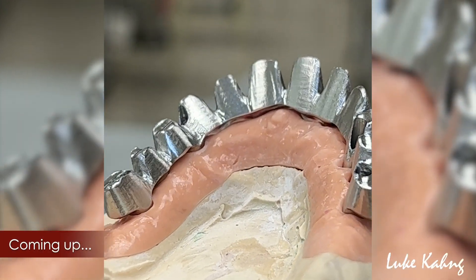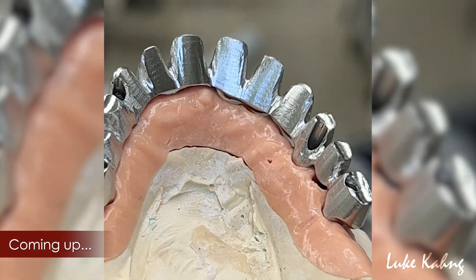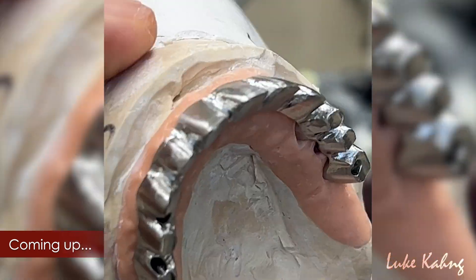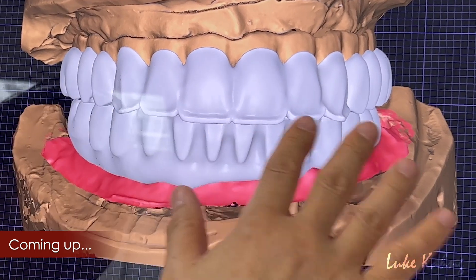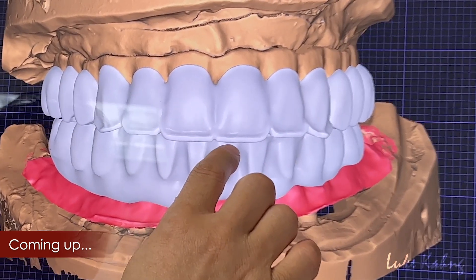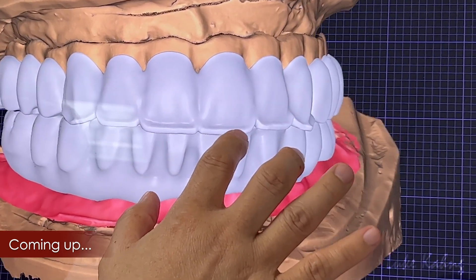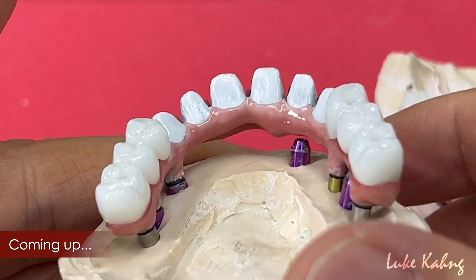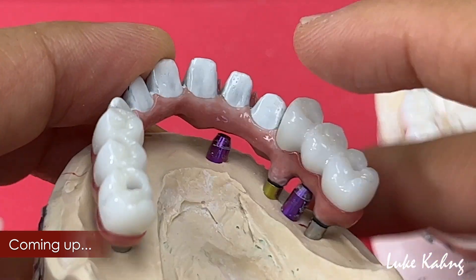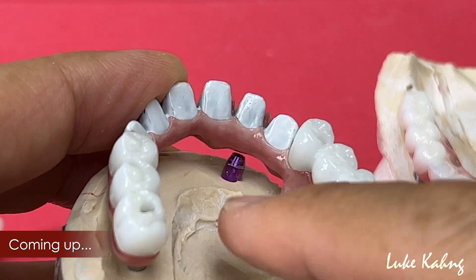We finished the five implant case. It's a bicon implant. It's extremely thin and long span for anteriors. Zirconia is not recommended. This is what it looks like — we overcome the obstacles about the long span and trying to make it as thin as possible.